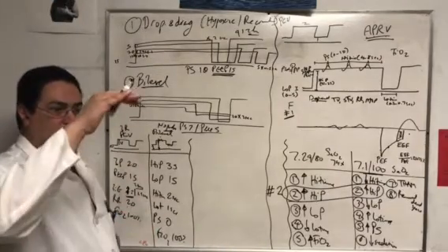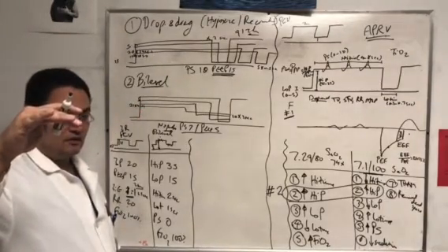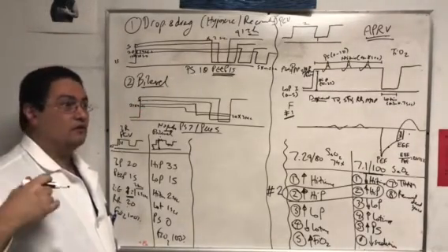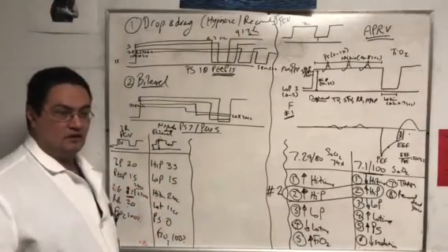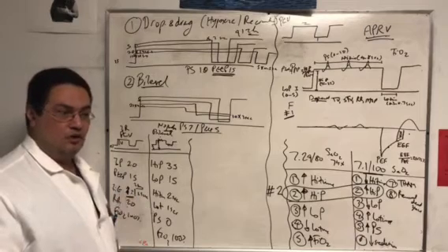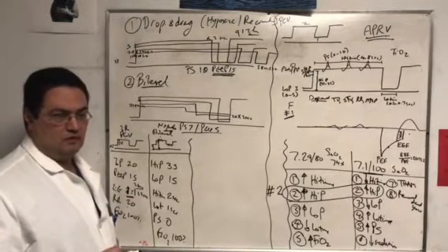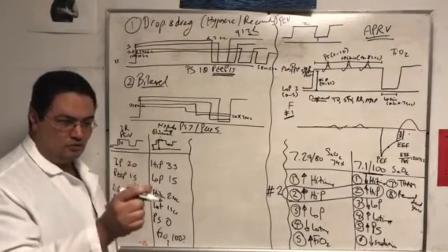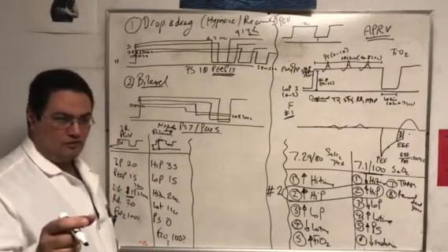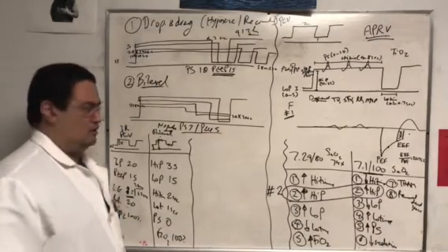So as I'm going up, 35 of pressure for 5 seconds, no venous return, I'm giving you another 5 seconds of a huge amount of venous return, right? So at least the venous return is not gonna be affected in somebody who doesn't have lung disease, or very minimal lung disease, right? So that's why you see we start at 2 and 2, and then go to 4 and 4, 6 and 6, 8 and 8. We never go the other way around.